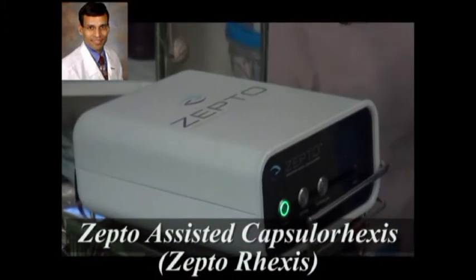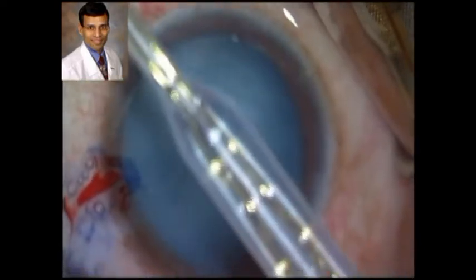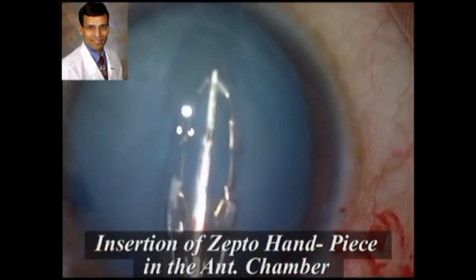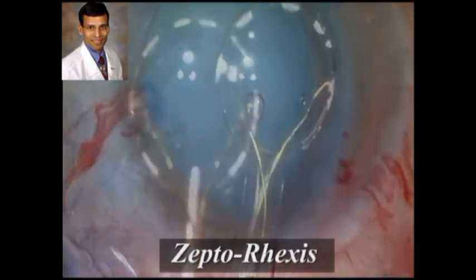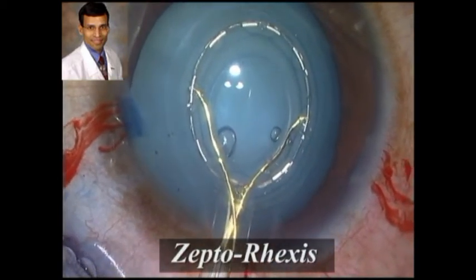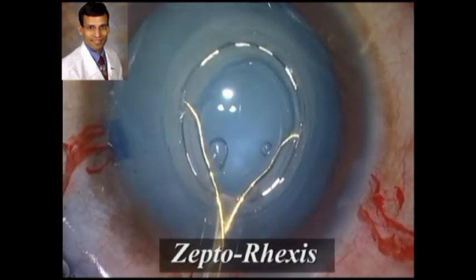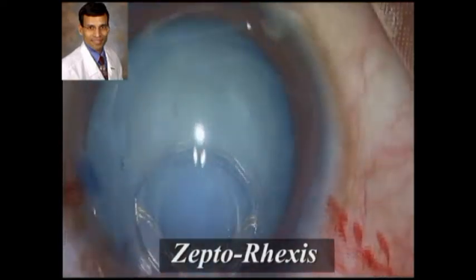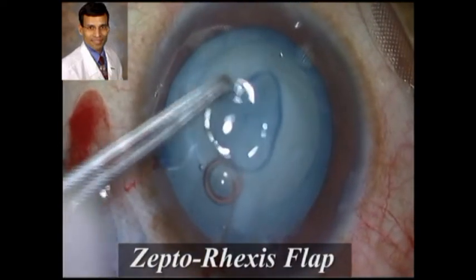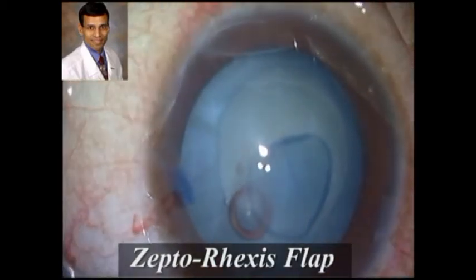This is the Zepto device — the console and handpiece are attached and the handpiece is primed. Here the device is being placed through a 2.8 mm incision that has already been made, though it can also be placed through a 2.2 mm incision. Once the device is well centered, we apply suction and deliver nano pulses of energy to create the capsulorrhexis, which can be centered on the visual axis under direct visualization — extremely important for premium IOLs.